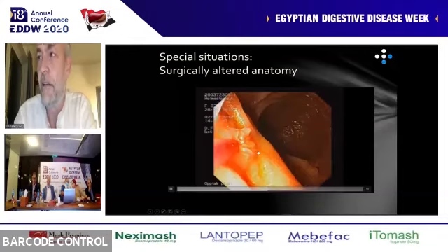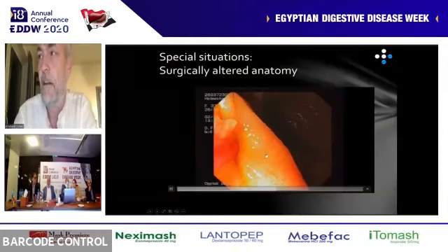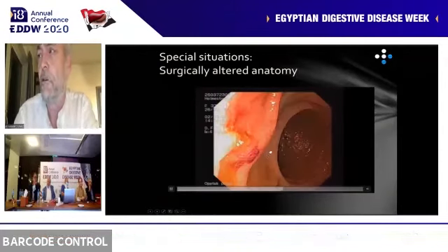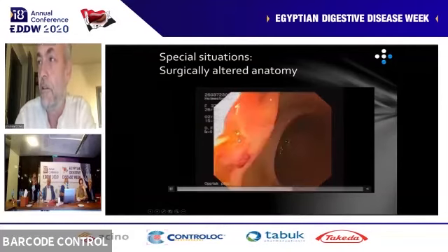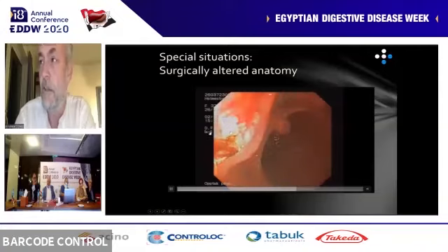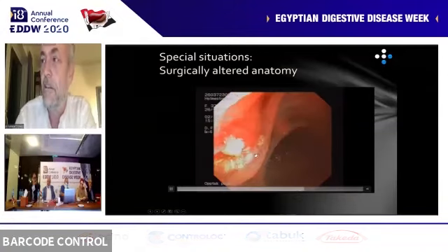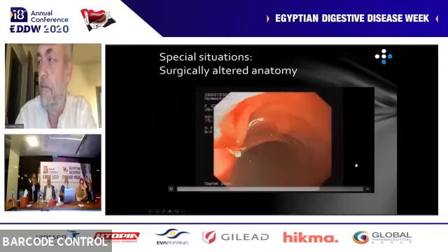And then when you get to the cannulation, doing the sphincterotomy is also usually a little bit cumbersome because the normal sphincterotomes don't work. So what we usually do then is to pass a guide wire and then use a needle knife like you can see here, and then cut outwards as much as we can, and then again expand the orifice with a balloon dilator.